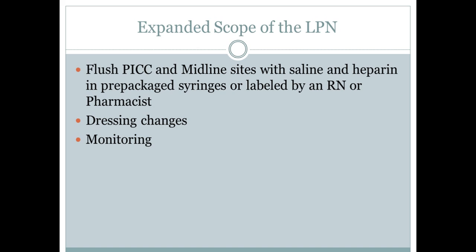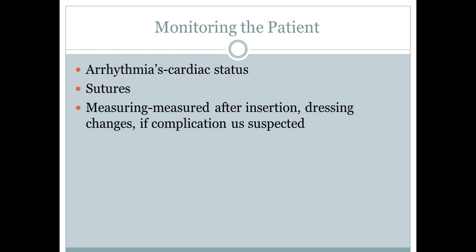You're also going to be responsible for monitoring the patient while they're having this therapy. So it's very important that you know what to look for, because since you are in that central venous access, that central vein, there are different things to look for than what you'd look for with the peripheral IV, specifically infiltration. You're not going to see the type of infiltration that you see with the peripheral IV line, with that vein being so close to the skin.